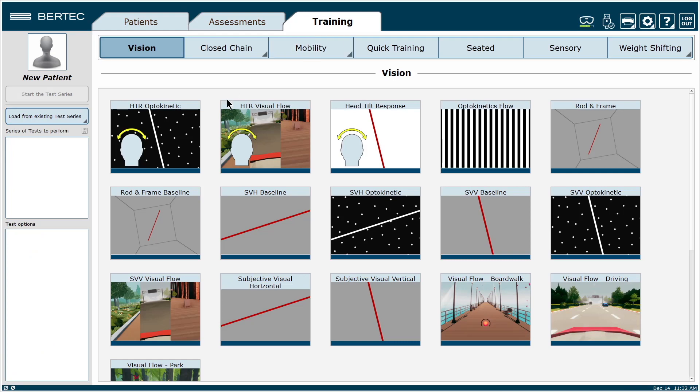If your HMD system is still not connected to Balance Advantage, please watch our Troubleshooting Tips video on how to reconfigure your HMD to Balance Advantage.